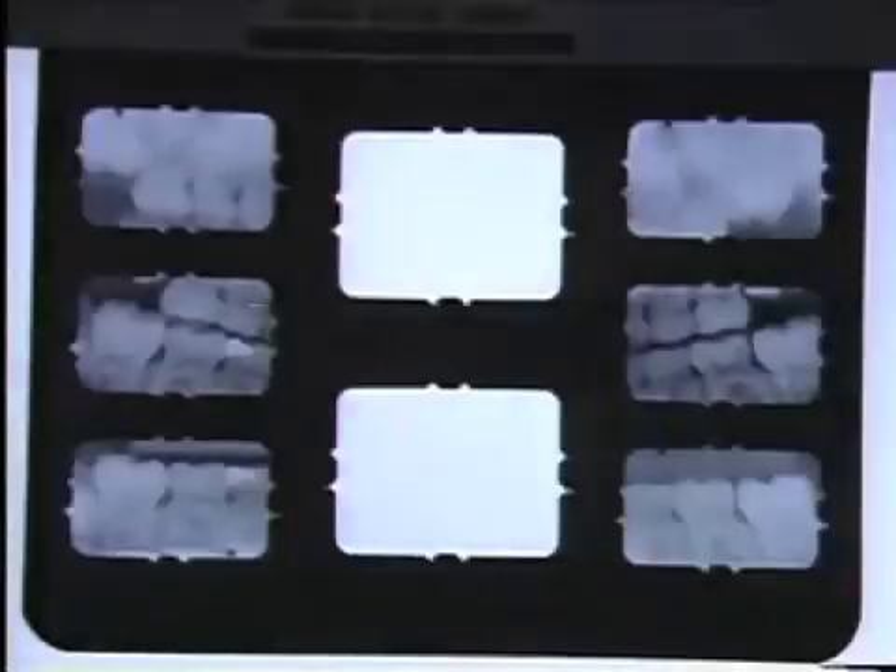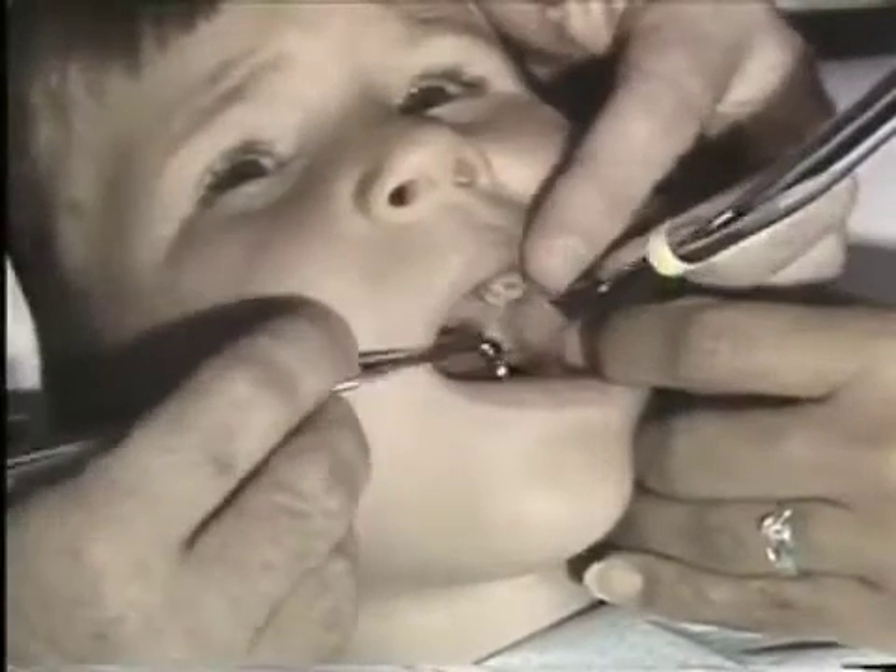Joshua is going to present some problems in the area of isolation. Looking at the x-rays, we can see that the lower first permanent molars, numbers 19 and 30, have erupted into the mouth and have reached the plane of occlusion. The maxillary molars are still covered with tissue, and it's far too early to consider sealant placement there.